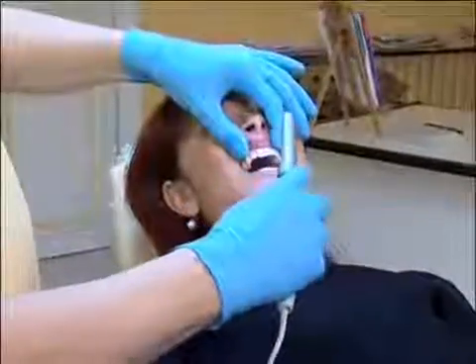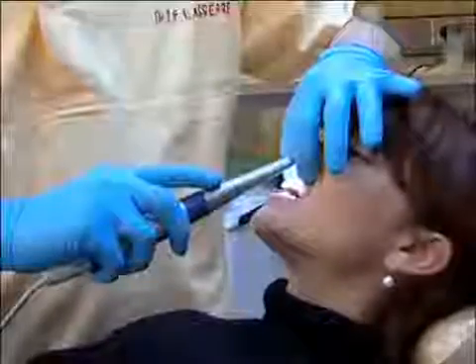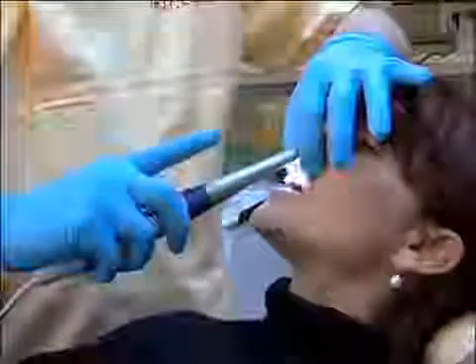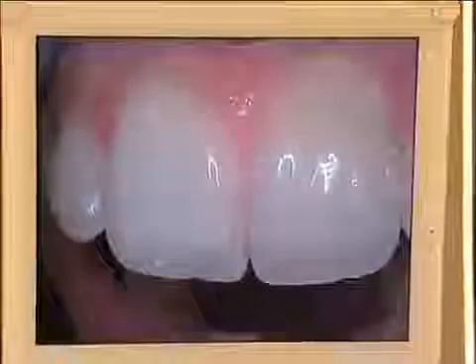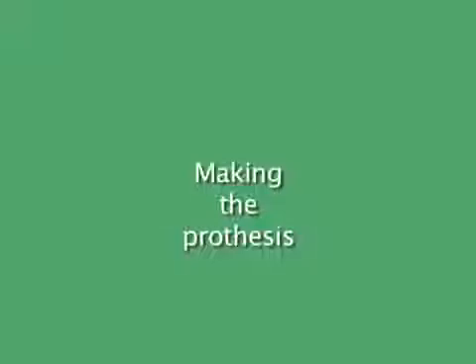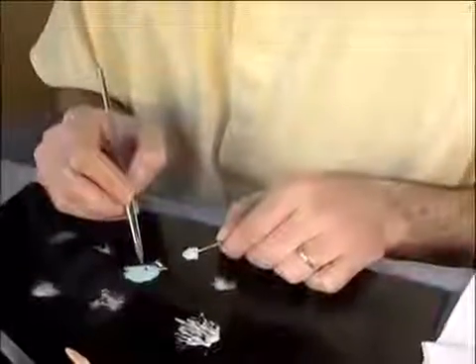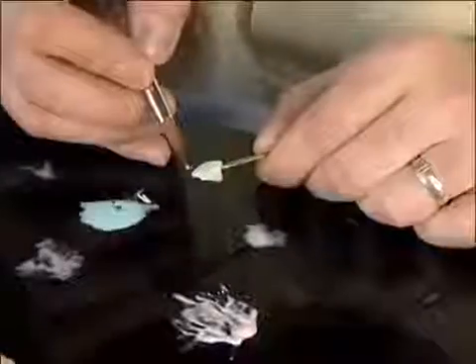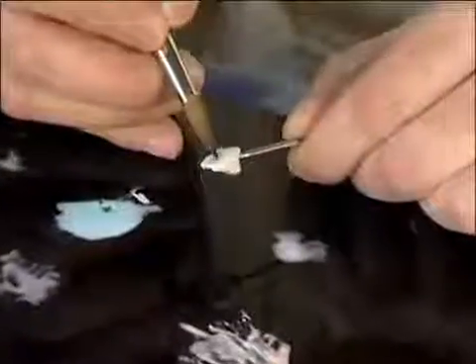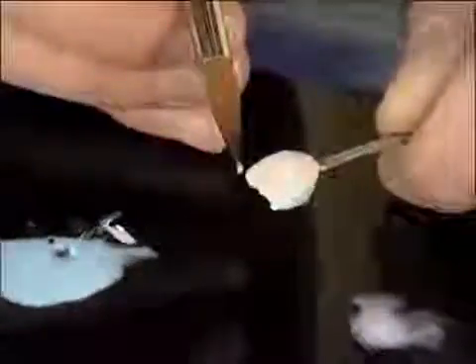A global view in macro photography of the tooth provides the prosthesis lab with all required indications on the cervical gradation, surface aspects, characterizations and incisal edge transparency. We start from the shade selection sample coming from the consulting room, and with our powders we will stratify so as to get all the natural effects of the tooth surface, deep 3D effects, bluish effects in the corners to get the final tint.